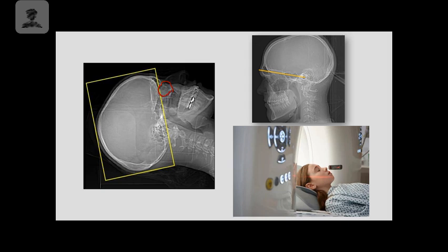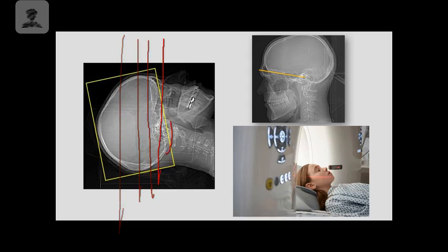So with this patient, if you were to just go ahead and scan the way it is, when we would be taking our slices, they would be like this. So when I get to the eye, because you see, I have to get all of this at the bottom.